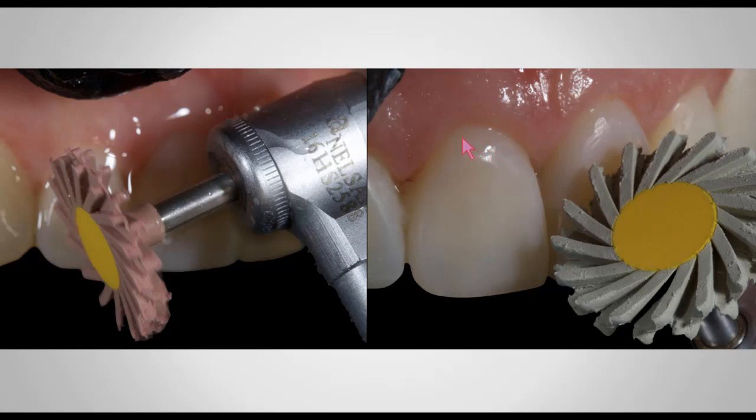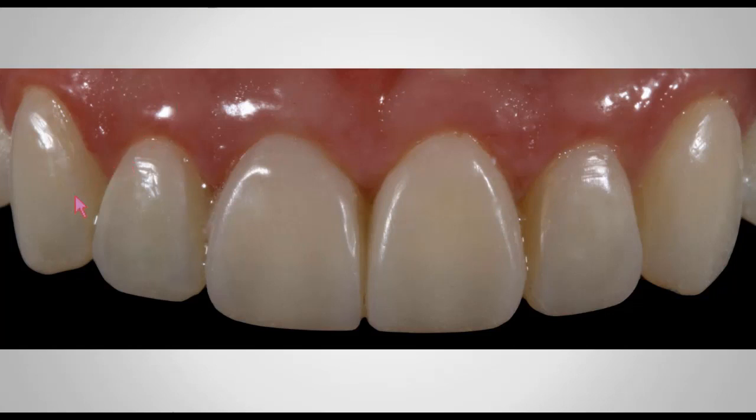So this tissue is never going to get inflamed. Same thing over here. But at the same time, you can see the contours, the line angles, the emergence profile, and then I sometimes use enhanced points, or I use these polishing wheels. Coltene makes very nice polishing wheels, and these are the ones that I'm using right here. And you can just go in and highly polish. This creates a super highly polished surface, and you'll see at the end how nice. Look at the way the light shines around the line angles and how smooth the entire surface is.